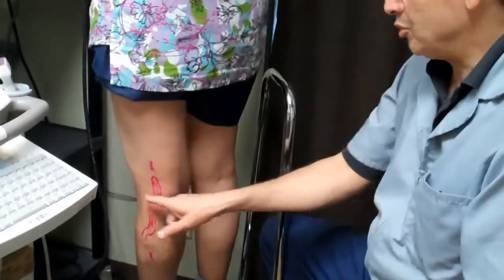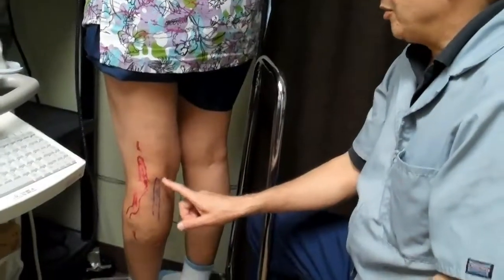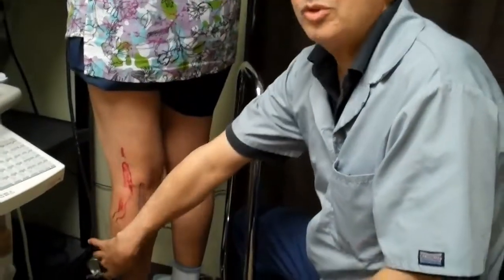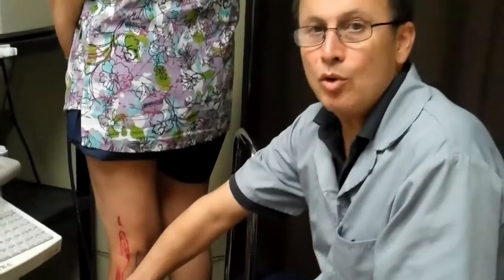So I hope that we all look for this vein at the posterolateral lower thigh or posterolateral knee. And when we see the short saphenous vein, our test is not completed. We should always look at it, especially patients who have posterolateral left calf varicose vein or even pain without visible varicose veins. And the best treatment for it is the foam washout technique, which I have explained elsewhere, and it could be seen on YouTube under foam washout.